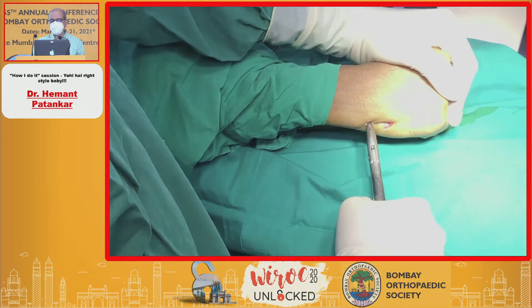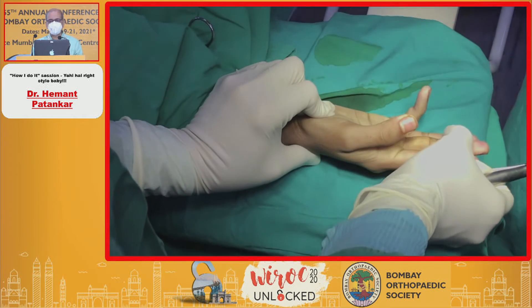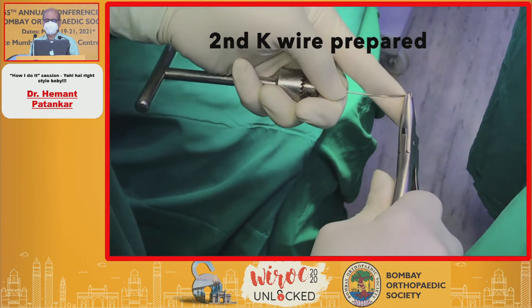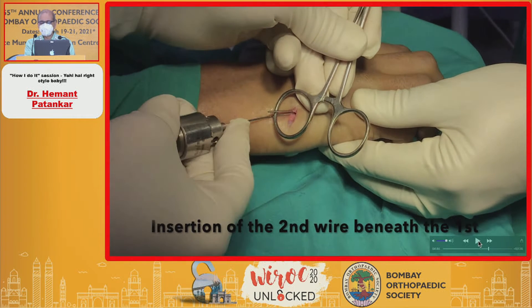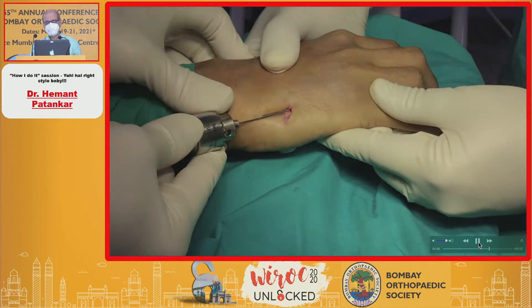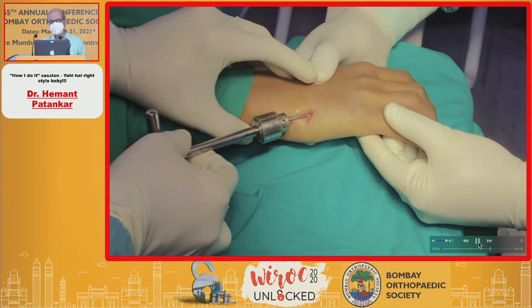You may use a gentle hammer and tap it further depending on how it looks on the C-arm. Now you prepare the second, third, and fourth K-wires depending on the size of the intramedullary canal. It is better to insert multiple wires than to insert a single thick wire. The second K-wire is also prepared — the sharp end is cut and it is bent. It is difficult to insert the second wire by hand, so use a small T-handle. Remember: the second K-wire cannot go above the first one; it has to go underneath the first one, then you withdraw and rotate it as needed.